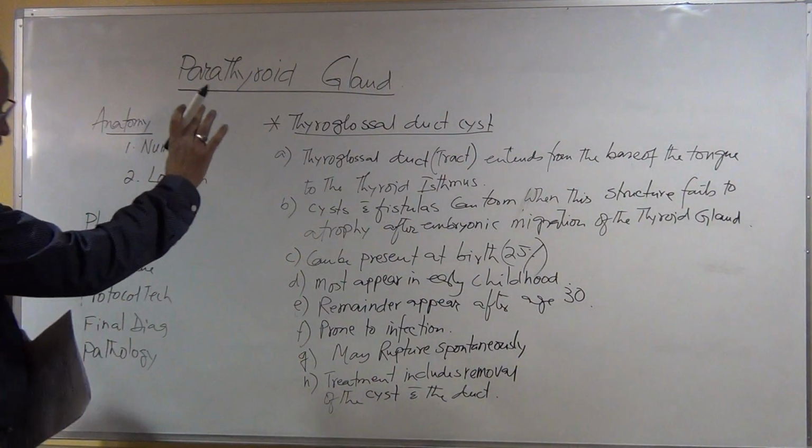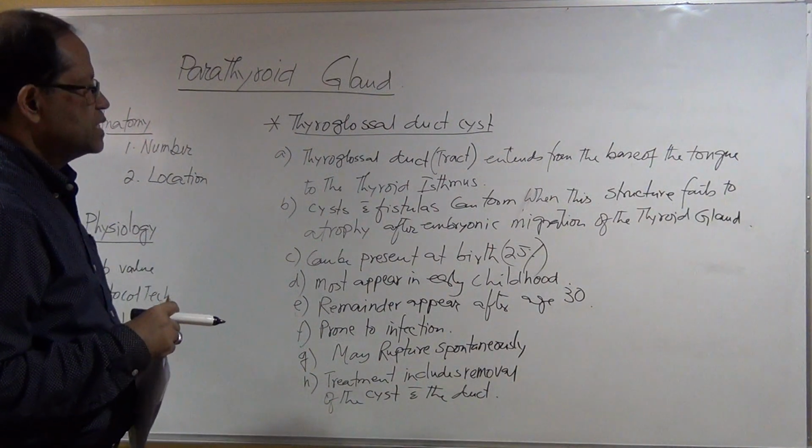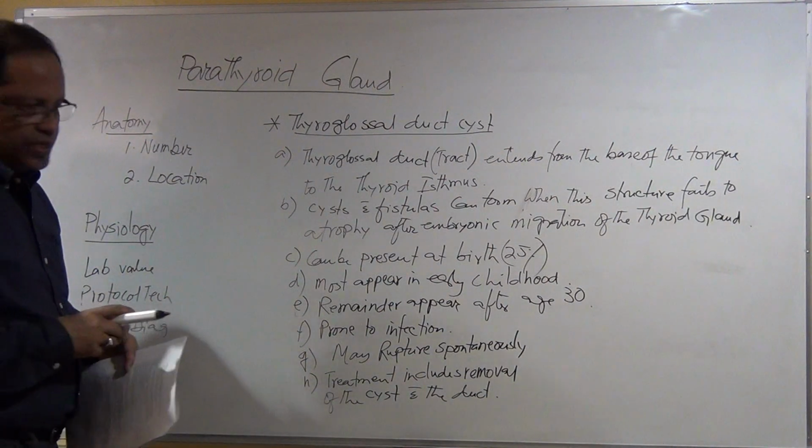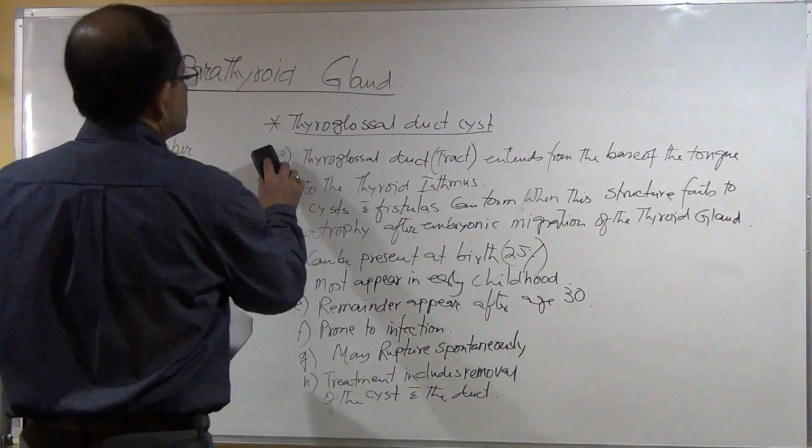Okay, this is the summary of the thyroglossal duct cyst. Now I will talk about the sono appearance.